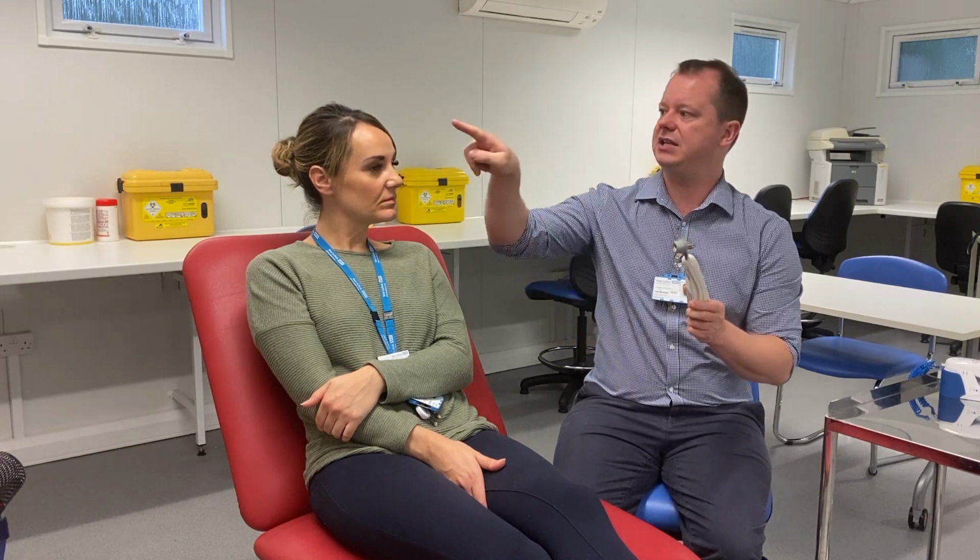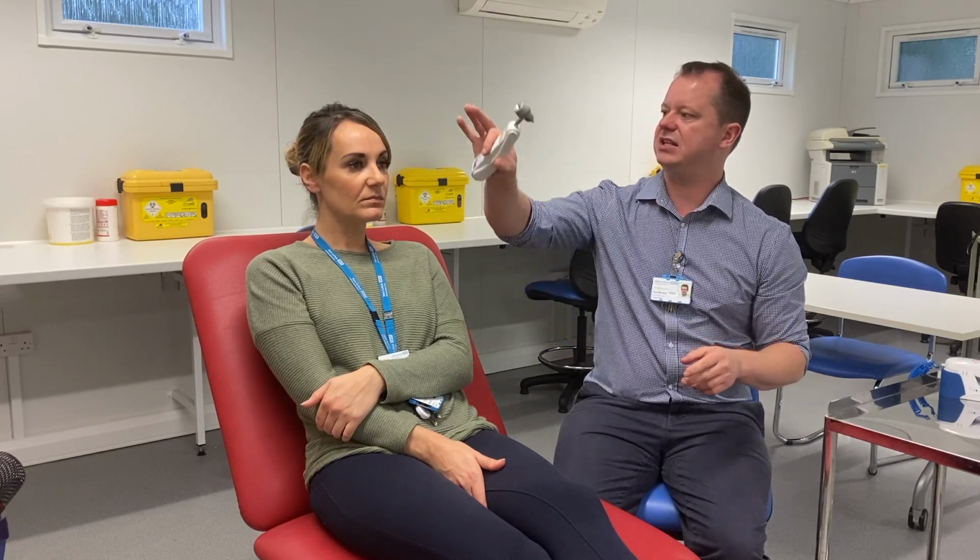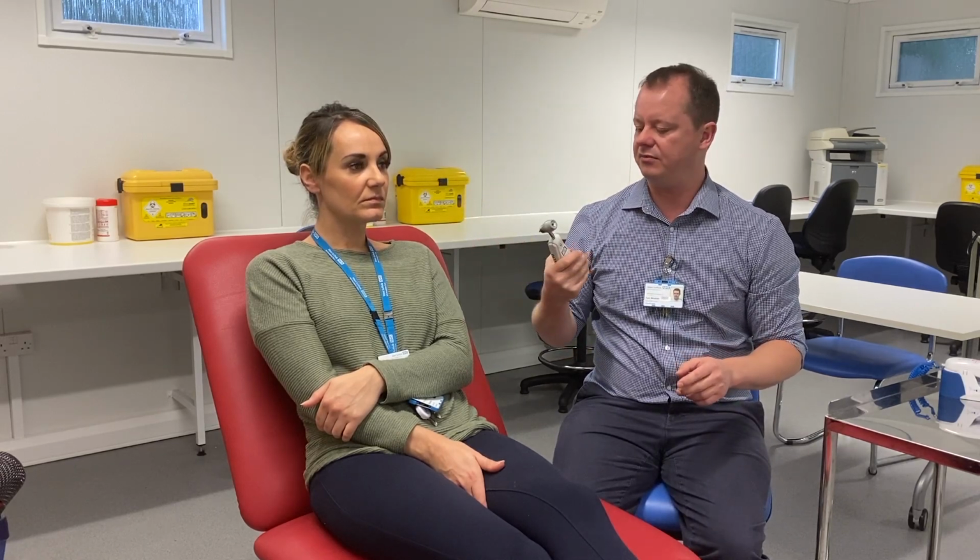The other method that you might see at Western Hospital is this temporal artery thermometer. So this is a thermometer that looks at the temporal artery going across our face and then behind our ear to see what the temperature is of the patient. For this one, again, make sure the machine is all clean and dry and in working order. And also make sure your patient doesn't have any wounds or anything you're going to wipe the thermometer through.